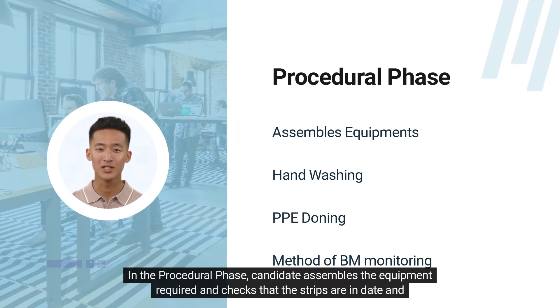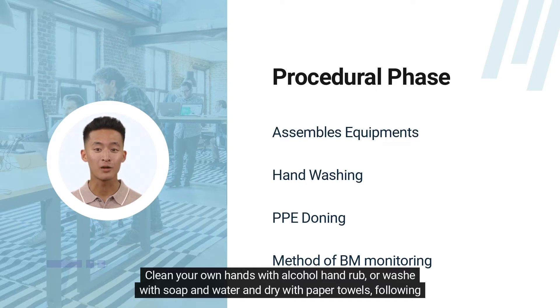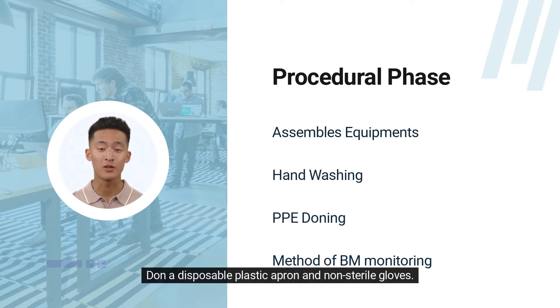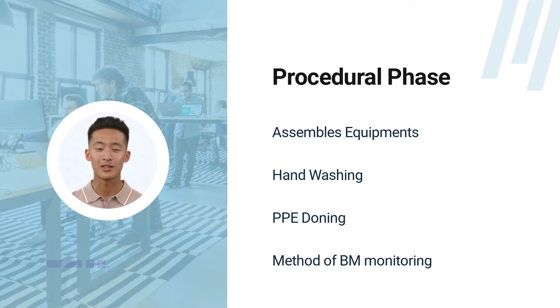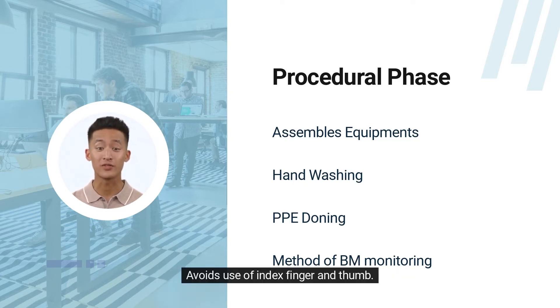In the procedural phase, the candidate assembles the equipment required and checks that the strips are in date and have not been exposed to air. Clean your own hands with alcohol hand rub or wash with soap and water and dry with paper towels, following WHO guidelines. Don a disposable plastic apron and non-sterile gloves. Check that the patient's hands are visibly clean. Take a single-use lancet and take a blood sample from the side of the finger, ensuring that the site of piercing is rotated. Avoid use of the index finger and thumb.